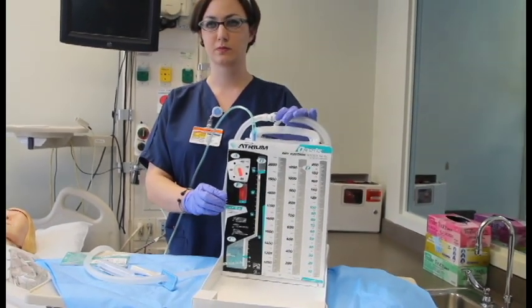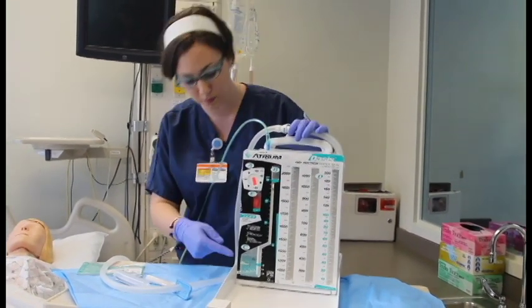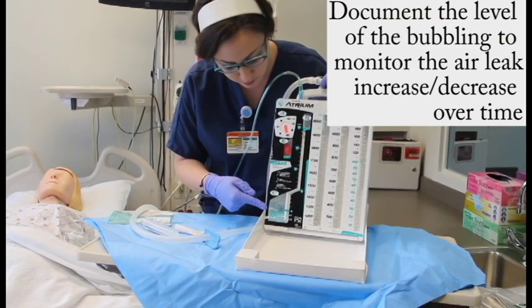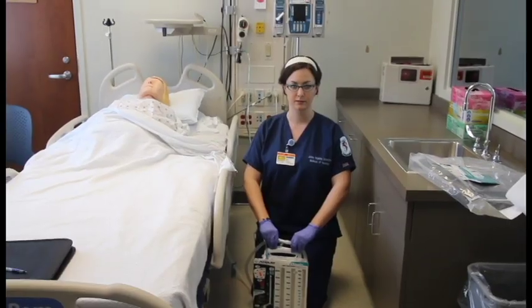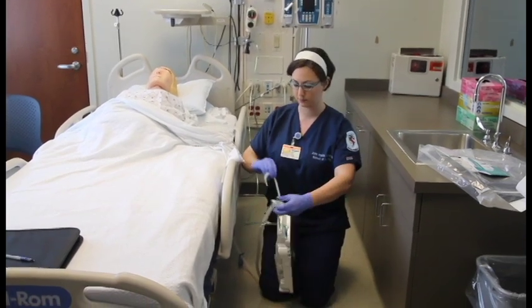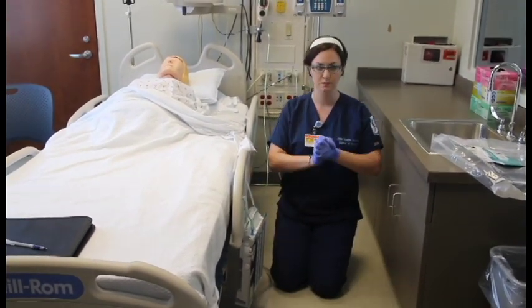Use the air leak meter to help you investigate for air leaks. If you see vigorous bubbling, you will know that there is an air leak in the system. Hang the unit below the level of the chest. We are connected.